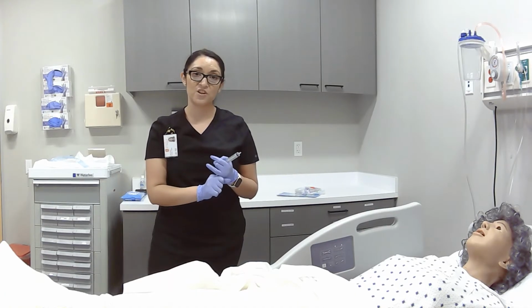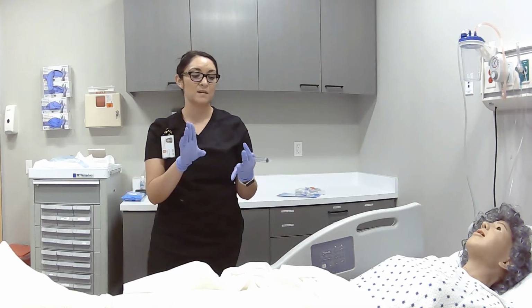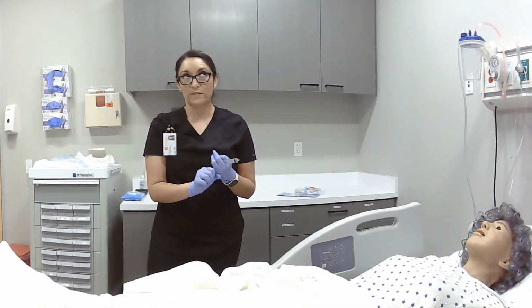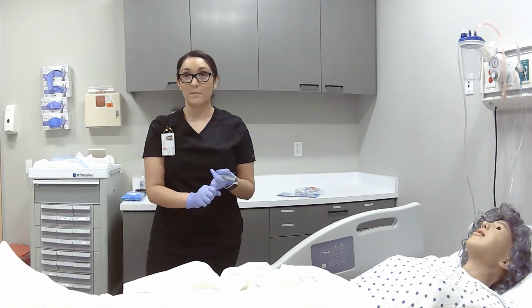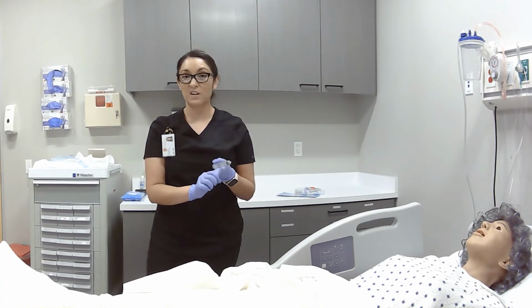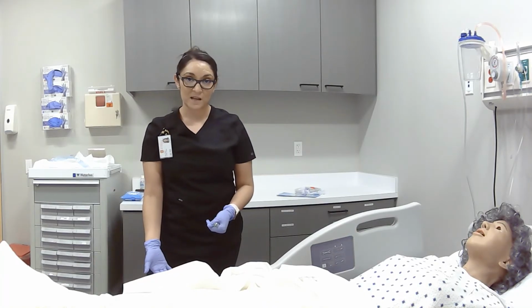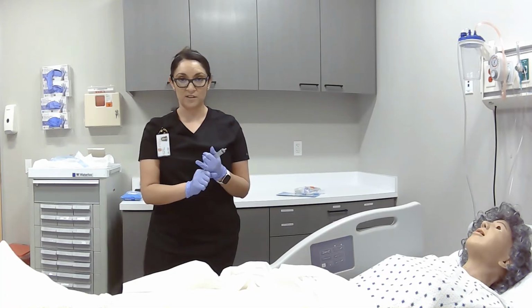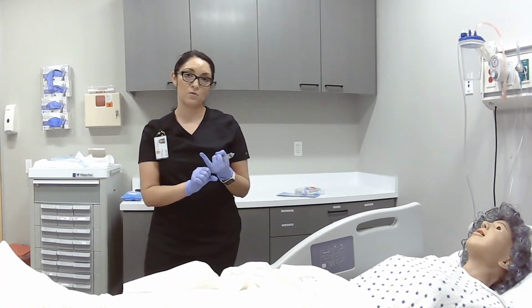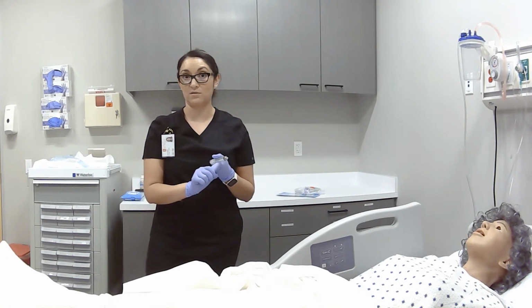So for the insertion, we need to document the number of attempts, what the gauge size or the Foley size is, what the patient's response was, and if there were any complications. We're going to do the same thing with the removal. So we want to document the urine, what the urine looks like, so COCA: color, odor, clarity, and amount.